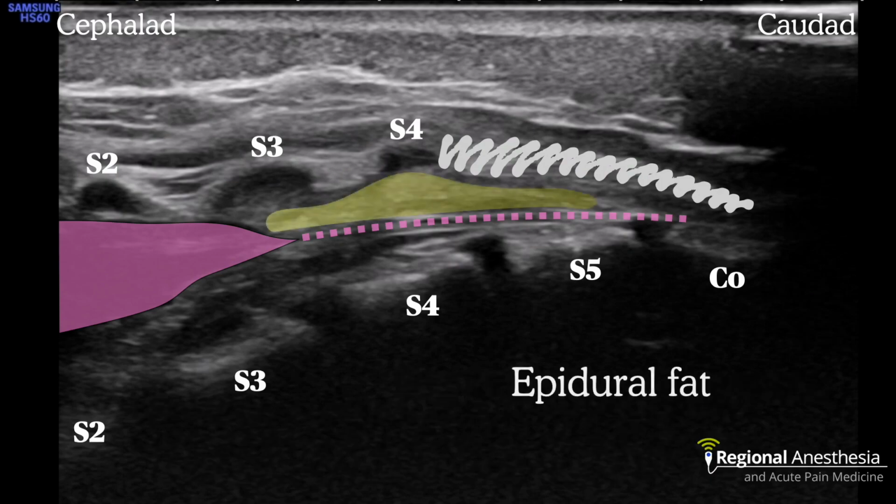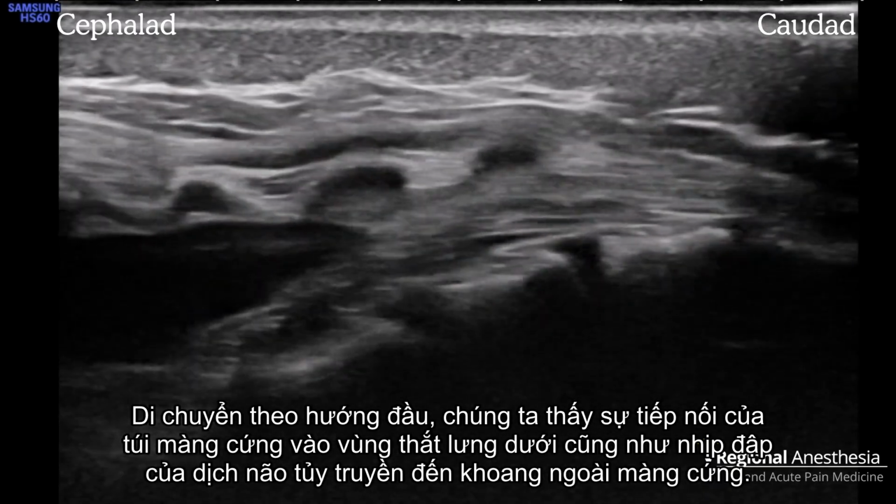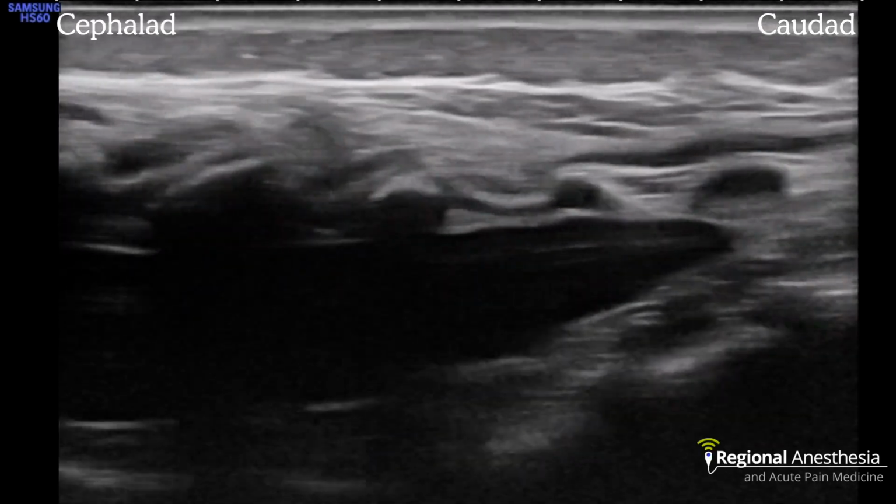The caudal space is occupied by epidural fat, seen here. Traveling in a cephalad direction, we see the continuation of the dural sac into the lower lumbar region, as well as pulsations of the CSF being transmitted to the epidural space.